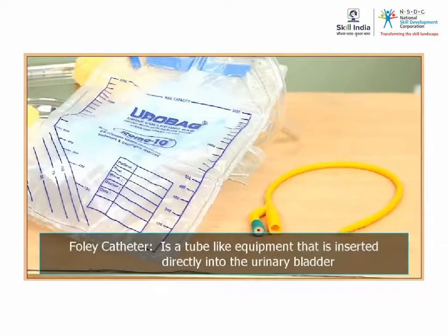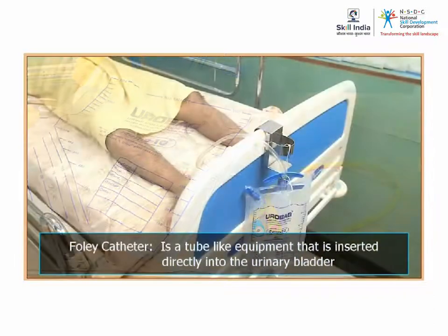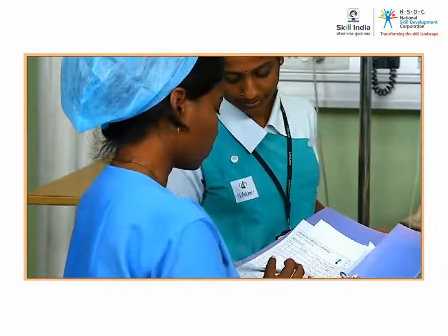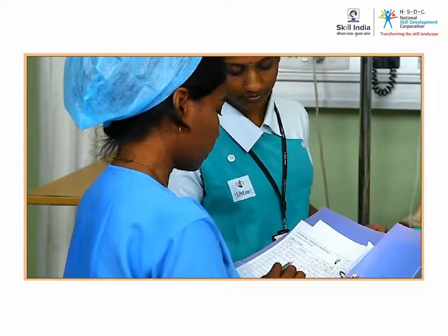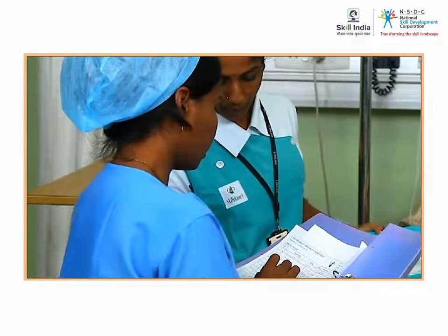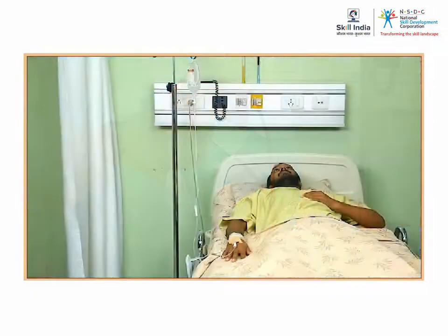Catheters are tube-like equipment that is inserted directly into the urinary bladder and used to empty the urine directly from the bladder. Based on the condition of the patient, the doctor would suggest the usage of the appropriate equipment. You must know the equipment to be used depending on the medical condition of the patient.